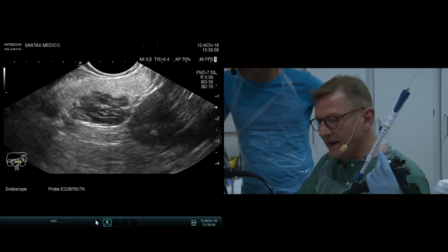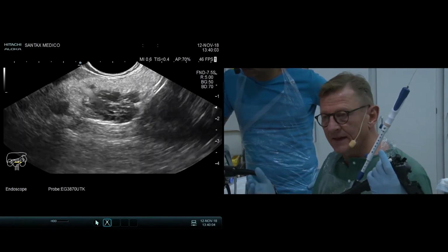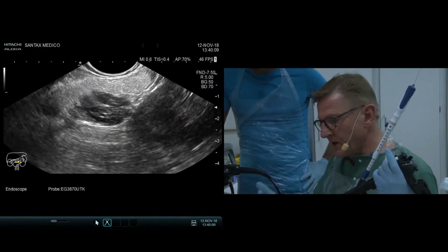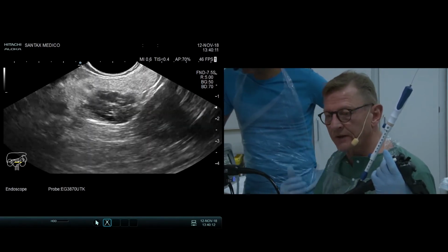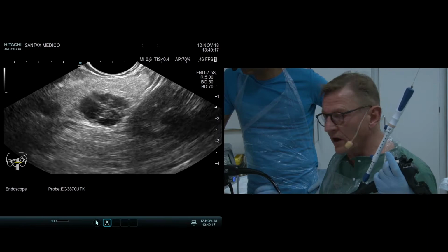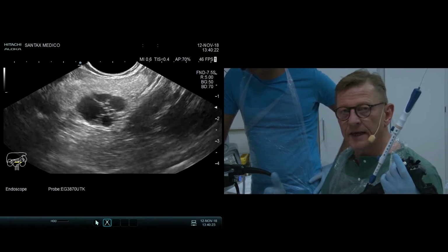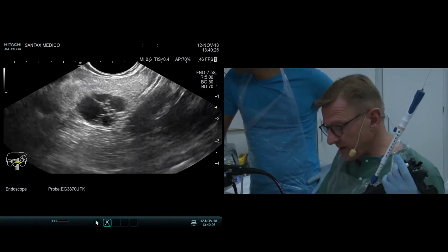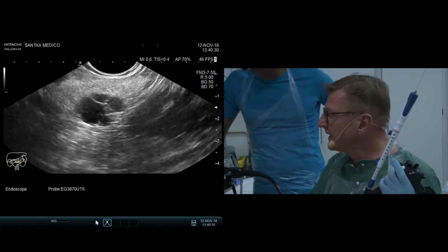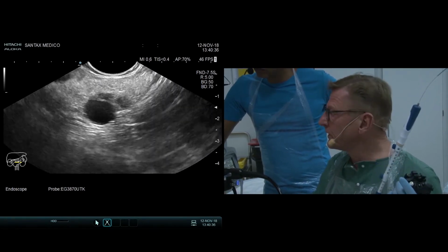But I agree with you that at the end it would probably be a multi-way of getting a look into the diagnosis based on contrast enhancements and based on cytology and microbiopsies and CEA, even genetic markers, proteomics, things like that. But we're working on that as well. But this is also for future discussion and a future conclusion on these things.